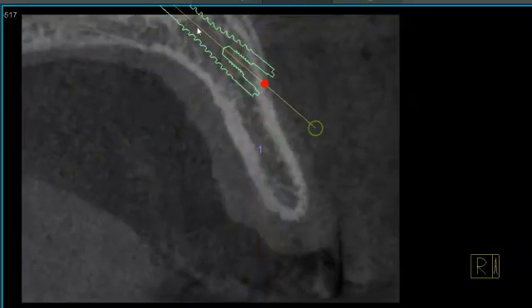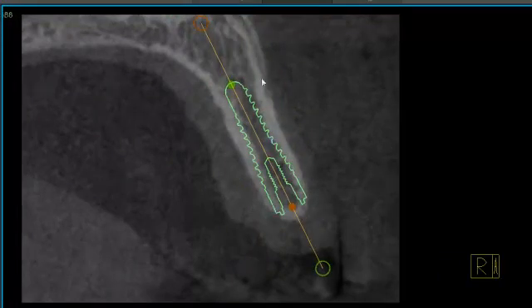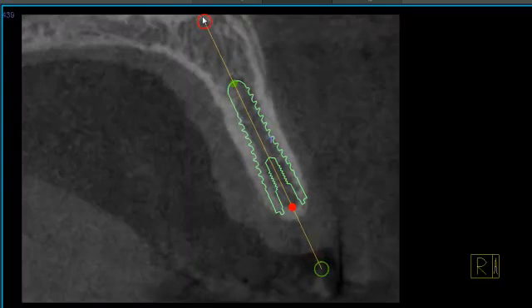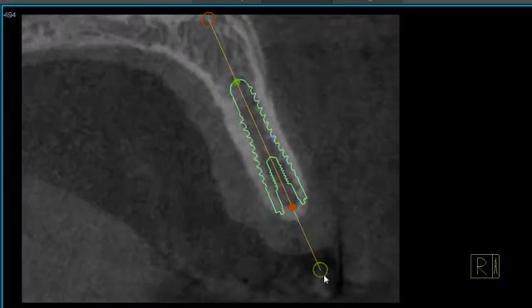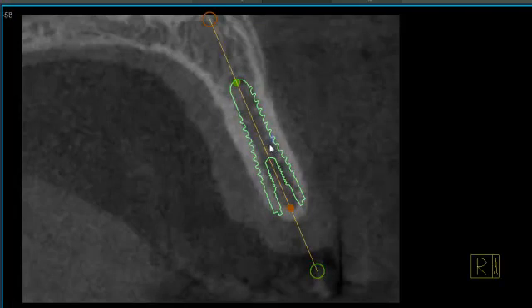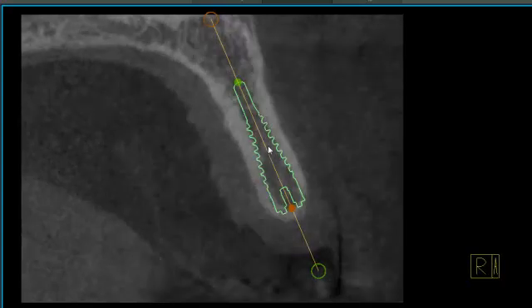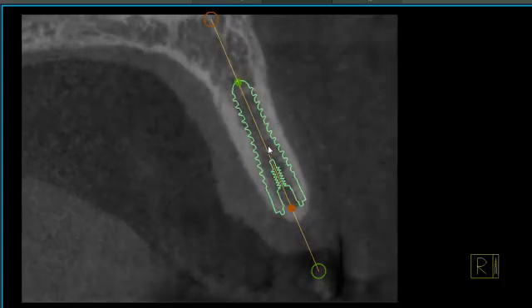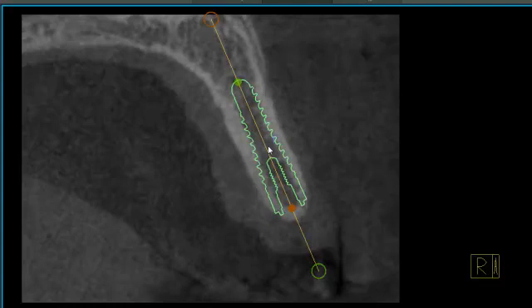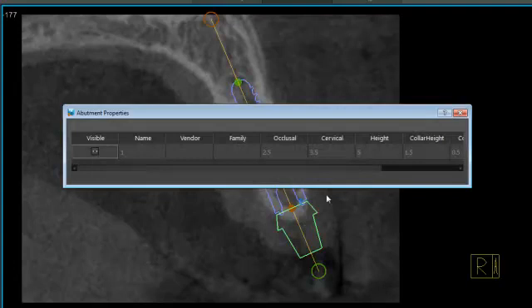Once I have dropped my implant in, it is very easy to move the implant around. I can turn it very easily, very quickly on its anchor points. I could also left click inside the implant and move it bodily. Of course, we can roll through our slices here. You can also go ahead and throw an abutment on if you like, and double click on the abutment to change any of the sizes as far as height or angulation as well.